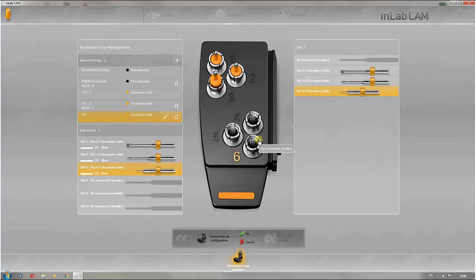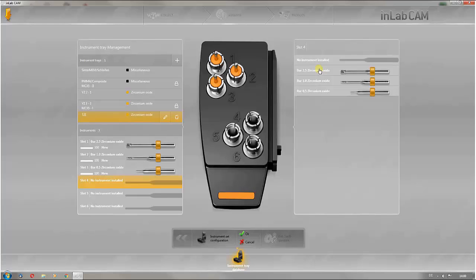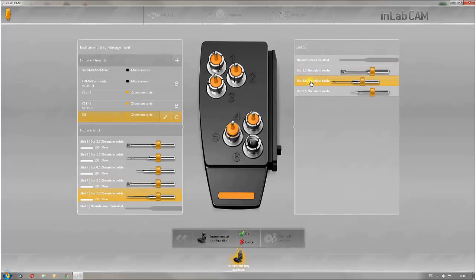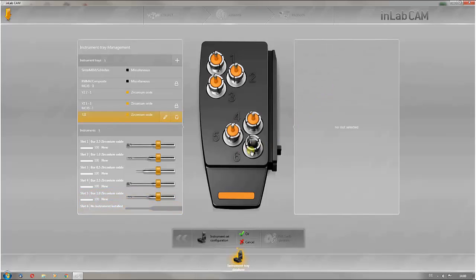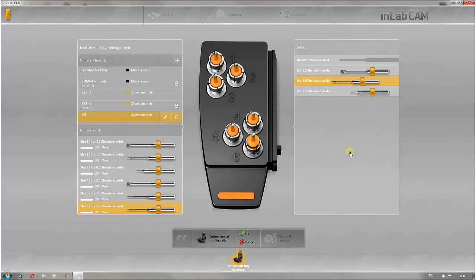It is recommended to assign the instruments which are used most to the free positions 4 to 6, so that there is a sister tool in the instrument tray for the tools which are used most frequently. Should the first tool become seriously worn, the sister tool can then be accessed.